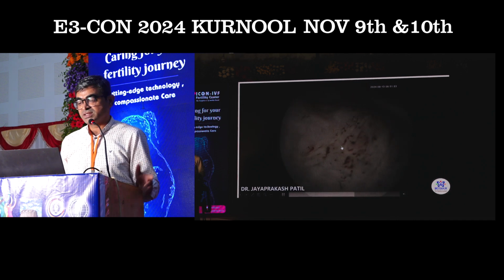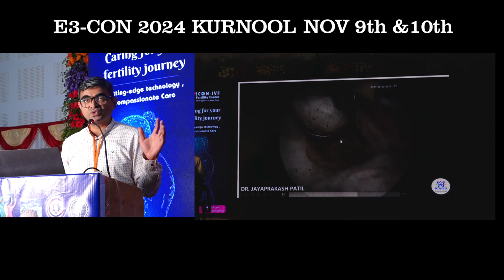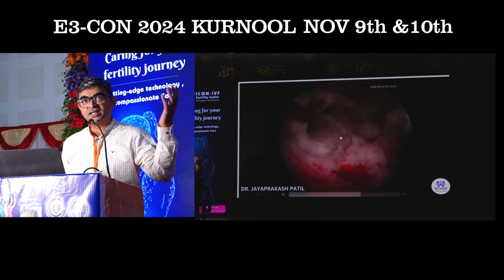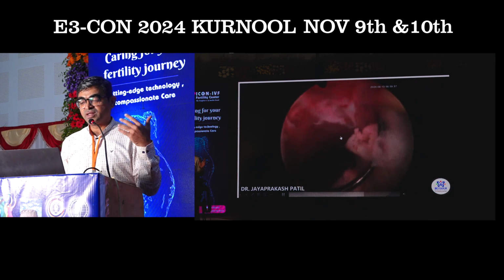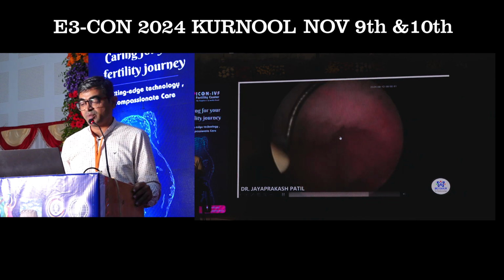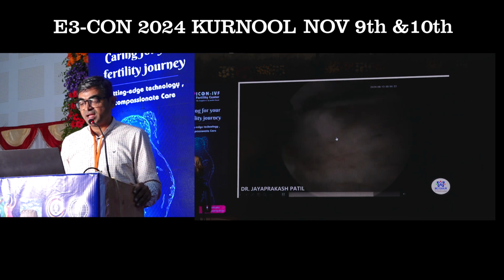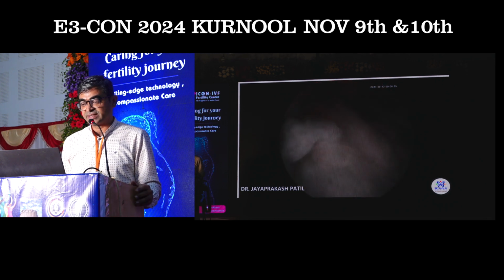This is how, because what will happen sometimes as an endoscopic surgeon, if you are told it is only coming from the cervical region, we only scoop it out without looking at the stalk which is there in the upper part. So once bleeding starts, the vision will be hindered. You will lose that information that actually this is coming from the upper body or the corpus region. So you will go and look for where it is actually beginning, and from there you have to resect it.